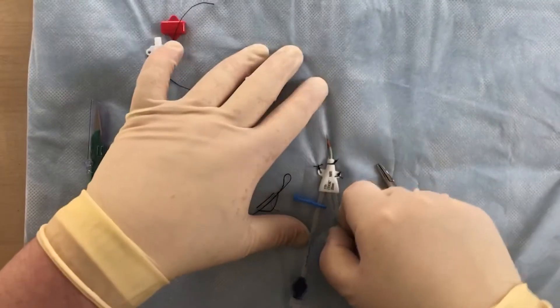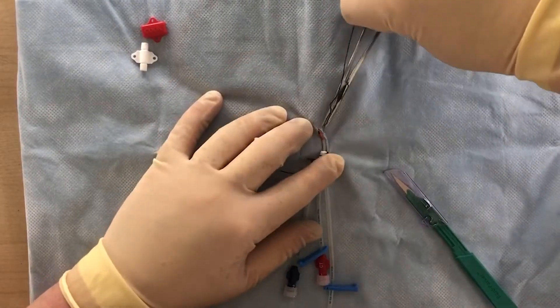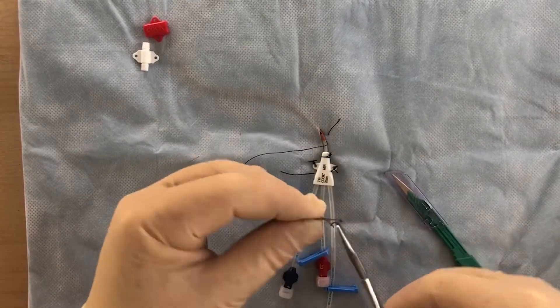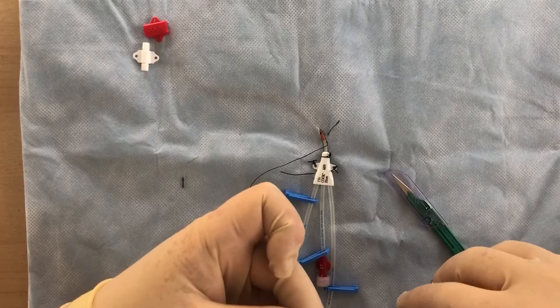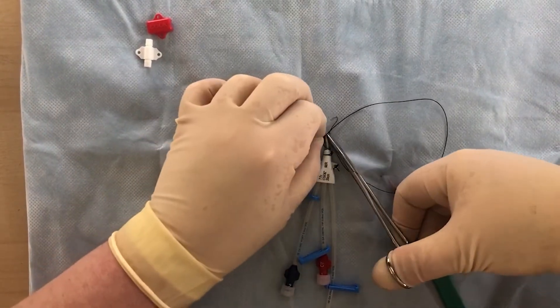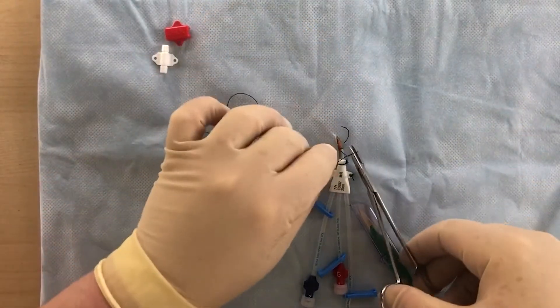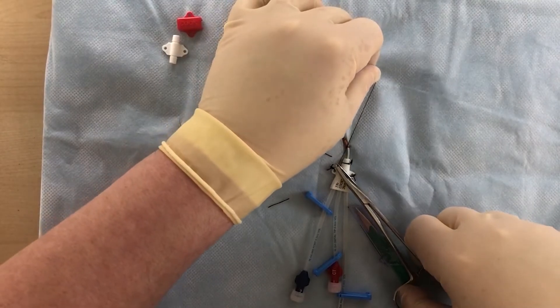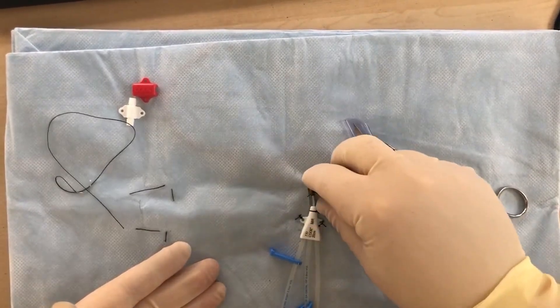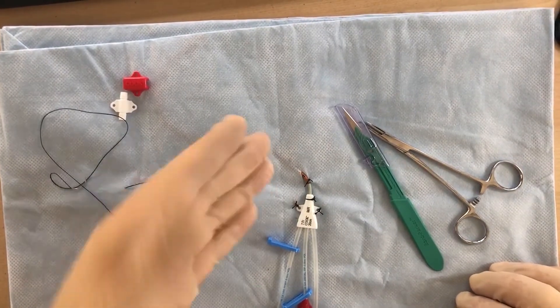As you can see, that's not going anywhere. It doesn't always purse-string it like I said, so in this case we can just make a little — remember to try not to pierce the catheter. This part is where I want to be very careful. To be extra safe, you can load the needle backwards so that you're not pushing the point under the catheter, and that will provide an extra layer of protection. Now I'm just going to tie that. You don't have to do this every time — only if there's a significant amount of space here. You don't have to secure it in four positions; this is only if there is a significant amount of space, which I thought was a little borderline, so I wanted to be extra safe.